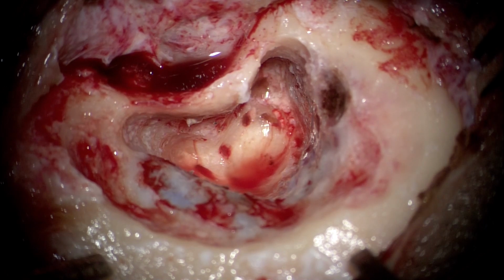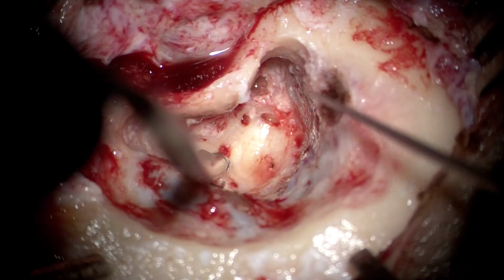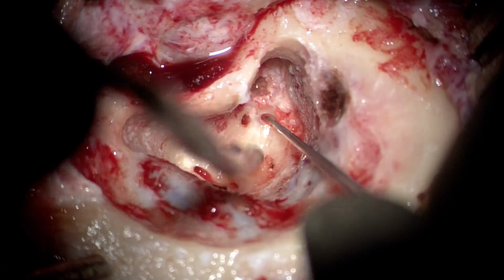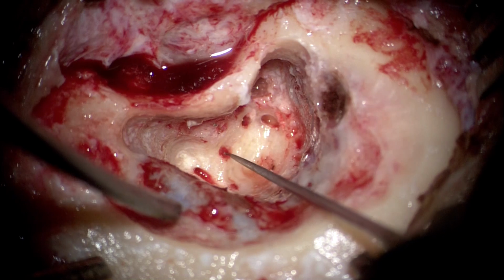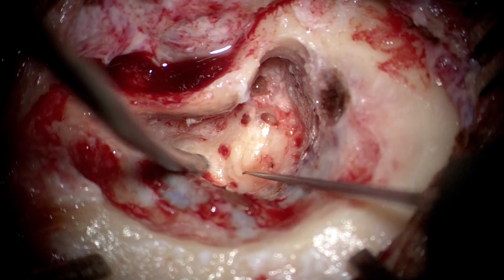So the boundary of our drilling in this patient, in this sort of situation, has to be completely respected. We cannot go anterior to the posterior ampulla, and we cannot go superior or anterior to the superior ampulla, because in both these situations, the vertical and the labyrinthine segments of the facial nerve respectively are structures to be respected.